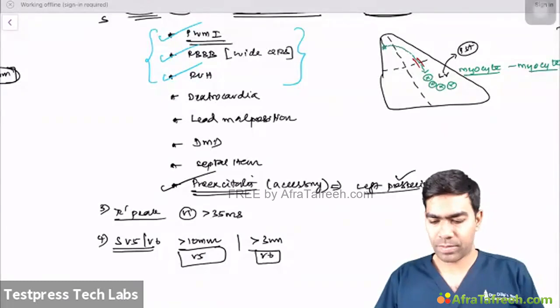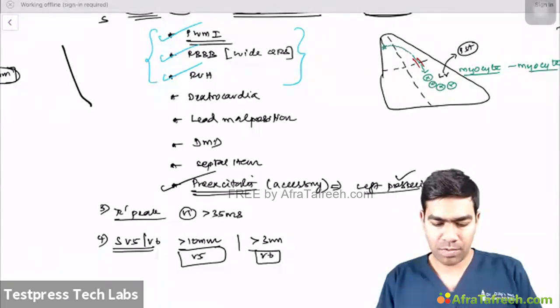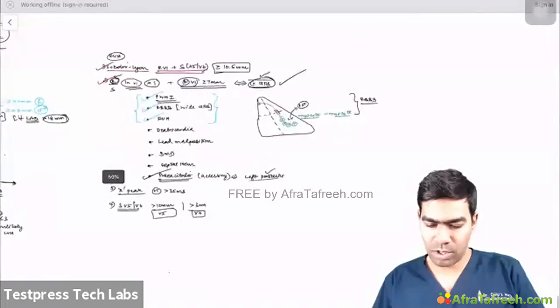Okay, cool. I think we have discussed the chamber hypertrophy. Next, now it's time to discuss the low voltage complexes.